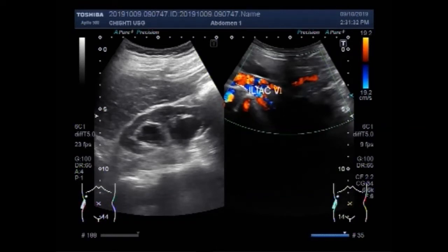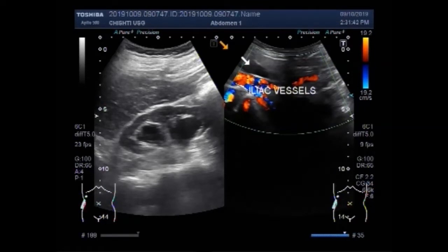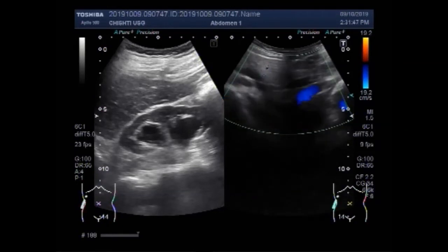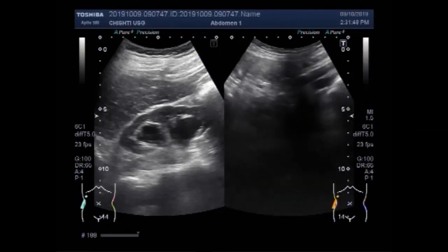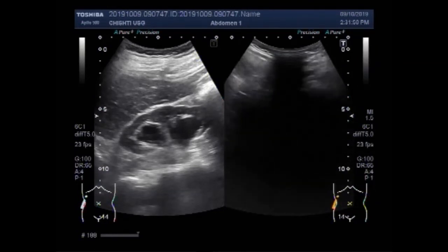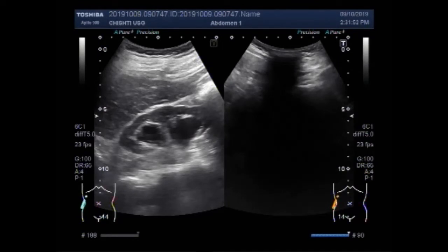These are the iliac vessels. And this is the right ureter. Again you can see the tracing of the right ureter.